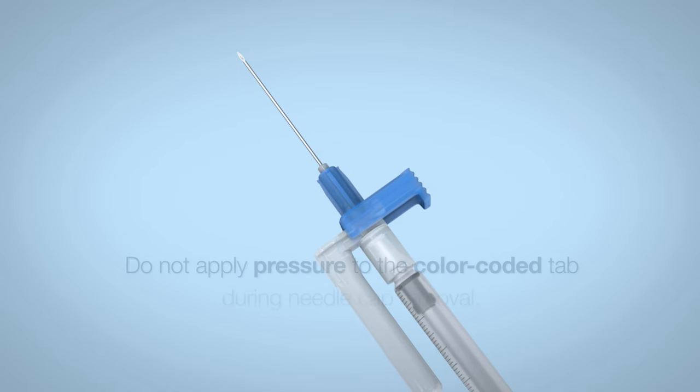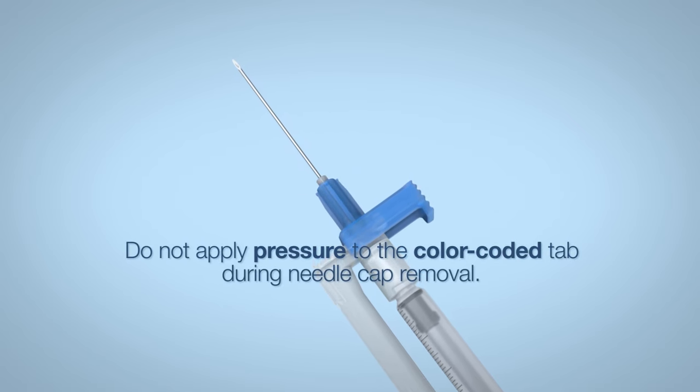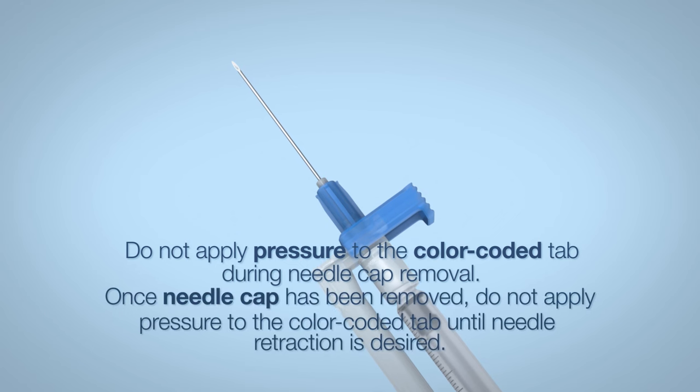Carefully remove the needle cap. Do not apply pressure to the color-coded tab during needle cap removal. Once the needle cap has been removed, do not apply pressure to the color-coded tab until needle retraction is desired.